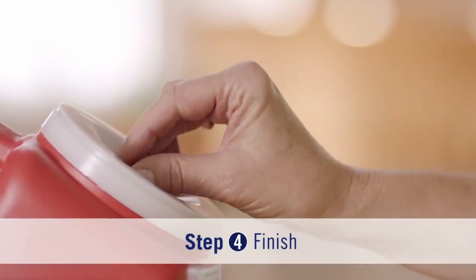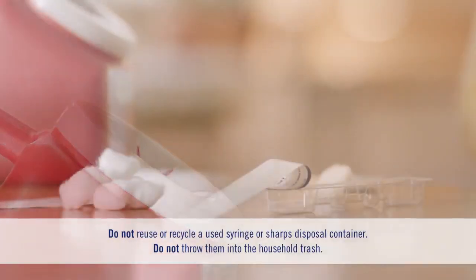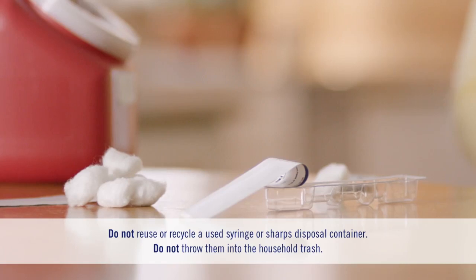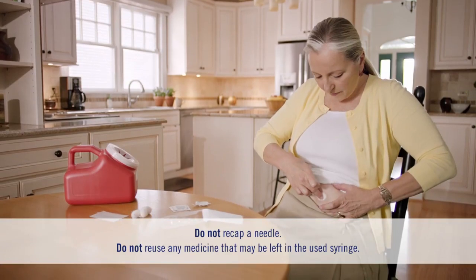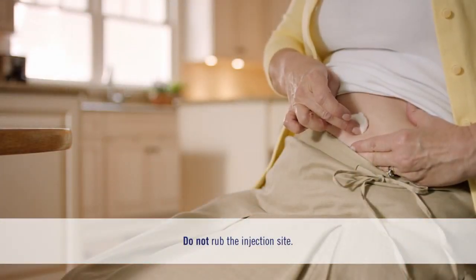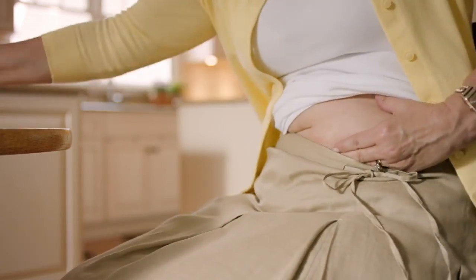Always put the used syringe into a puncture-resistant container. Never reuse a syringe or recap a needle. You never want to put the used syringe into the trash or recycle bin. Once you've properly disposed of your syringe, check your injection site. If you have a little bleeding, press a cotton ball or gauze on the injection site — just be careful not to rub it. You can put a bandage on it if you need to.